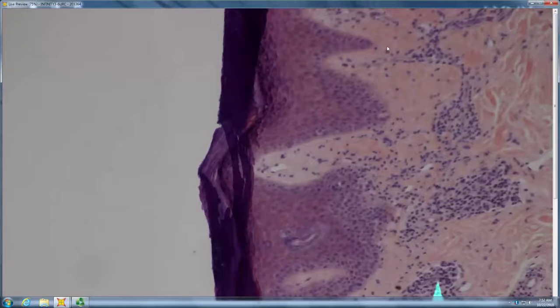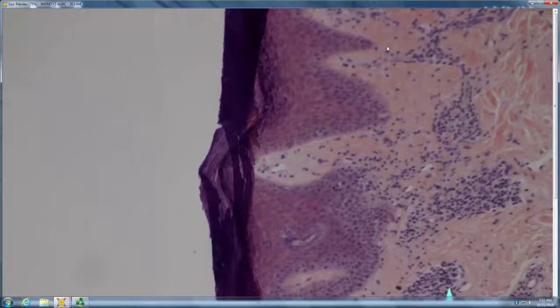Yeah. Now look at the vessel. Is there a bare underbelly sign, or are there plenty of lymphocytes under the vessel? I mean, they're kind of circumferential, so there are some underneath. Yeah, so it's not particularly a bare underbelly sign. So now I'm confused, right?